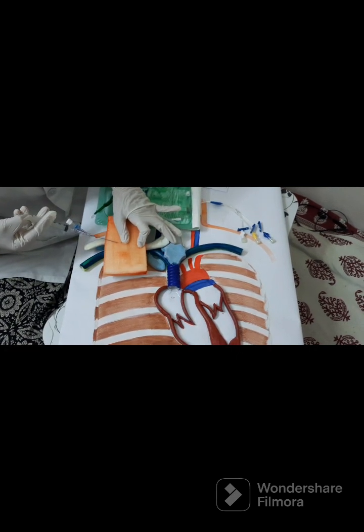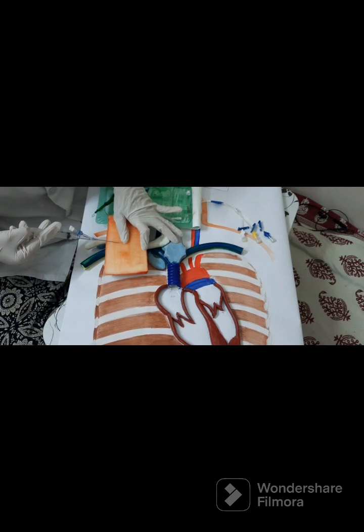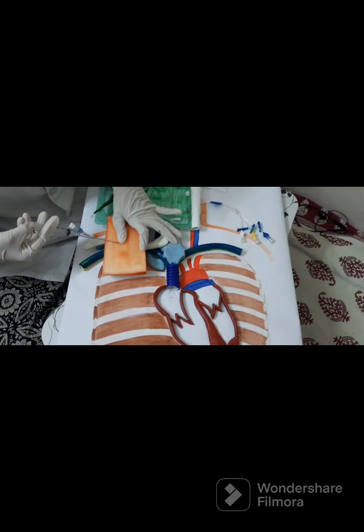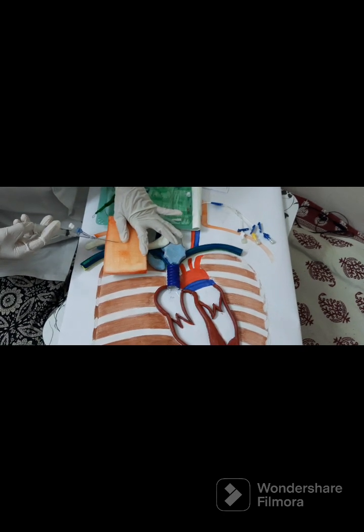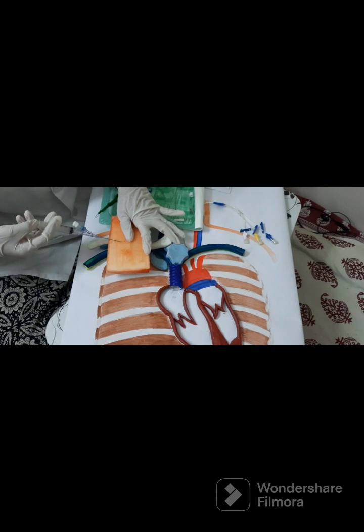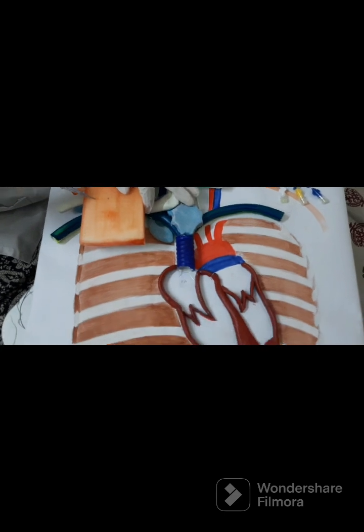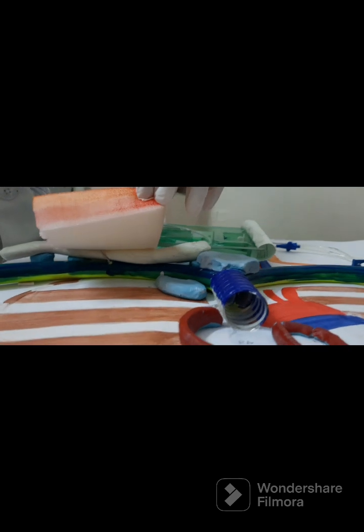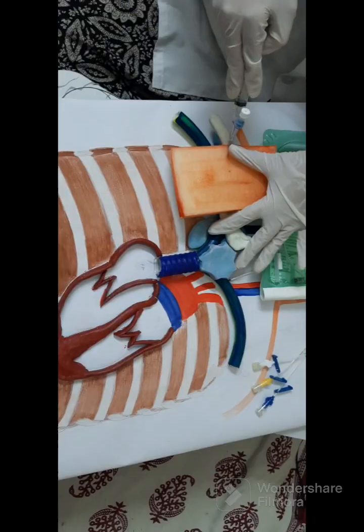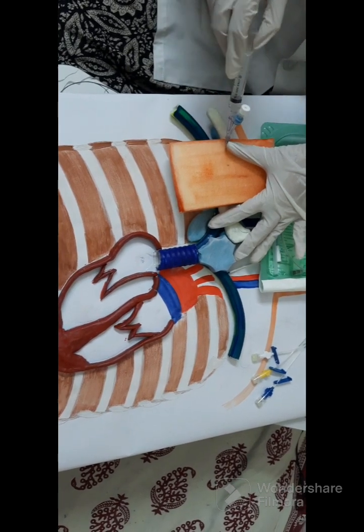Now I'm pushing the tip of the needle down. I'm pulling back on the syringe with the right hand and then I'm advancing under the clavicle in a straight line toward the sternal notch as the aiming point. We'll maintain gentle aspiration on the plunger so as to know that it hasn't punctured the vein yet. Vein puncture is signaled by aspiration of blood in the syringe and we will take the syringe off.